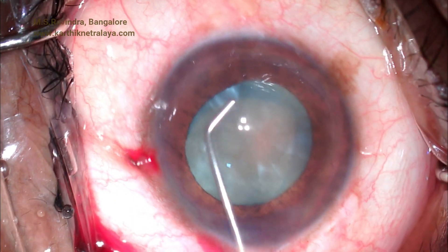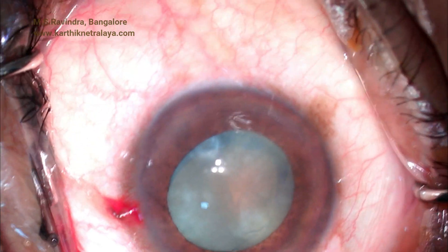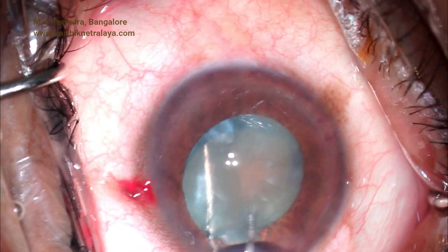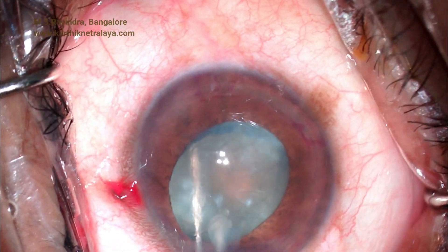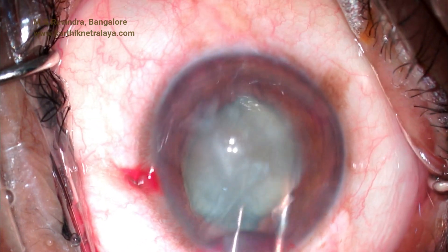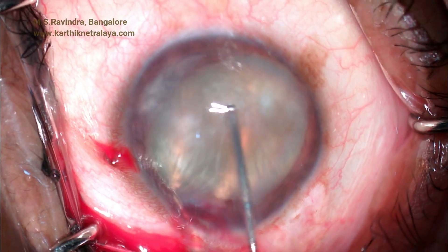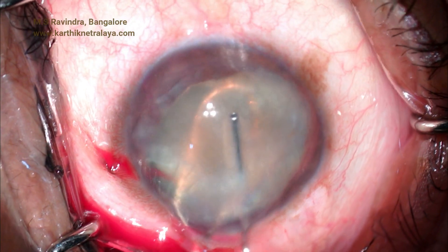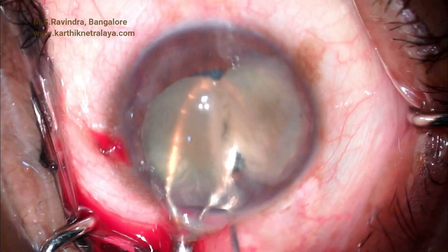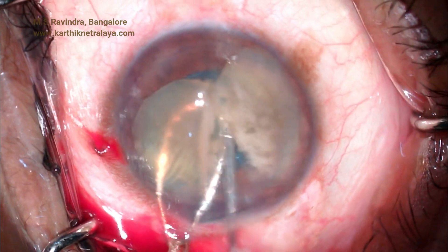The chamber is shallowing because of the Utrata forceps; care is taken not to depress the floor of the tunnel. Surgery is being done under topical anesthesia, so 1% lignocaine is injected into the anterior chamber. The nucleus is rotated bimanually into the anterior chamber, bisected, and the hemi-nuclei are taken out from the eye using a visco-infusing 25-gauge cannula under the protection of continuous injection of viscoelastic.